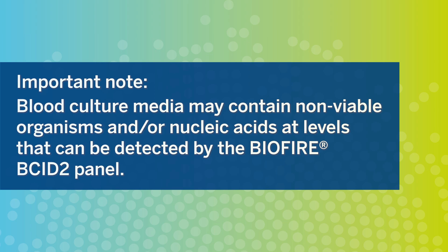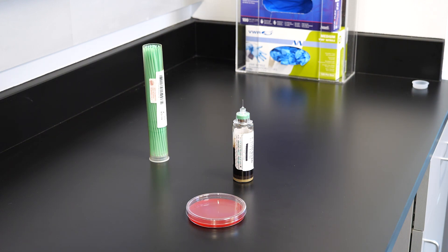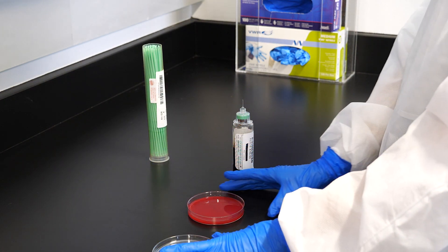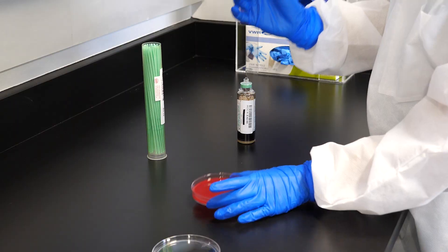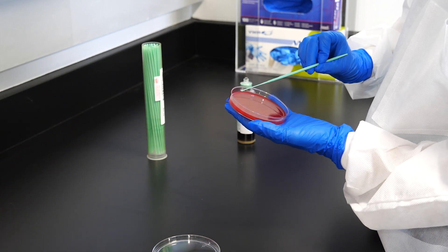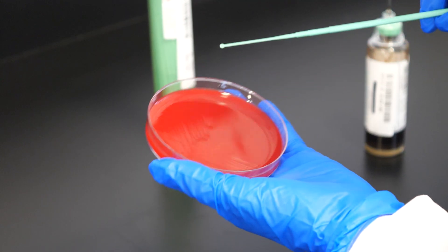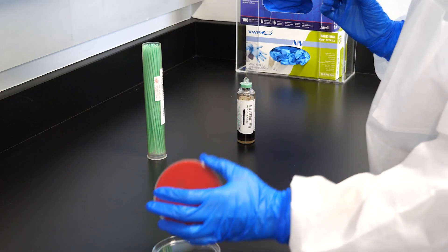Blood culture media may contain non-viable organisms and/or nucleic acids at levels that can be detected by the BioFire BCID-2 panel. All BioFire BCID-2 panel results are intended to be interpreted in conjunction with gram stain results. A discrepancy between gram stain and BCID-2 results will alert the technologist to the need for further testing for confirmation before reporting. Subculturing of positive blood cultures is necessary to recover organisms for susceptibility testing and epidemiological typing, to identify organisms not detected by the BioFire BCID-2 panel, and for determination of species detected but not identified within complexes, groups, or genera by the BioFire BCID-2 panel assays.